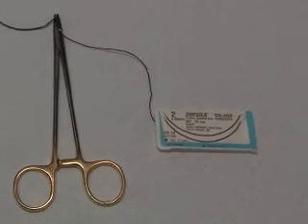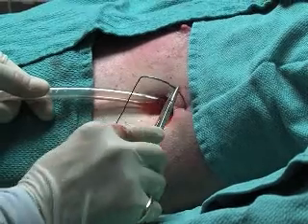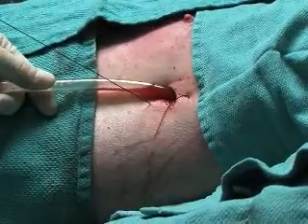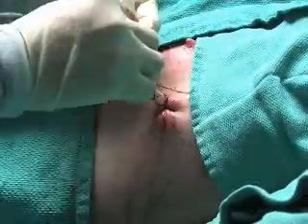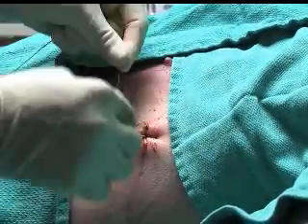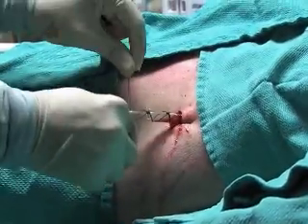Secure the chest tube to the skin using heavy sutures. Simple interrupted or mattress sutures are often satisfactory to ensure stability of the tube and avoidance of air leaks around the tube. The free ends of the sutures are wrapped around the tube and tied multiple times to secure it in place. Purse string sutures are not recommended as they yield poor cosmetic results and increase the risk of skin necrosis.